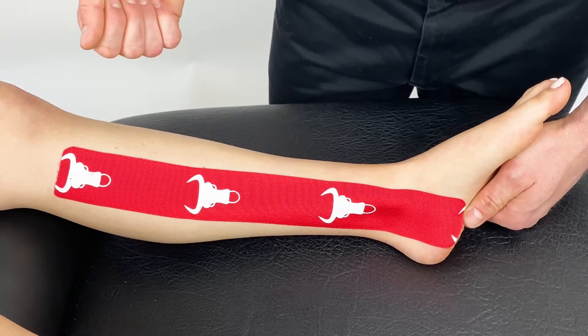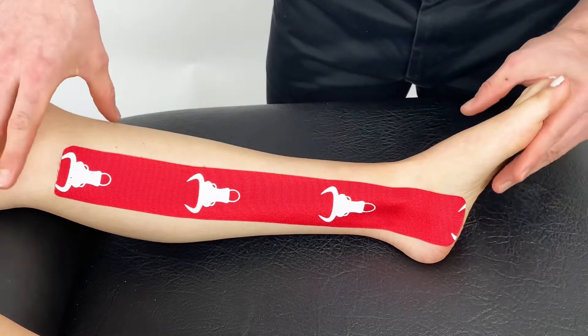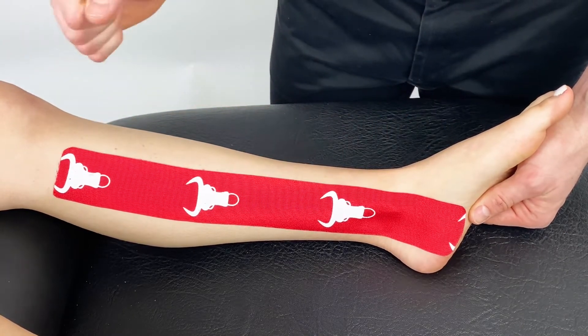This is the technique for medial ankle sprains. This tape has been applied with the ankle in slight eversion, anchored on the medial aspect of the heel and applied up the line of the soleus with mild tension.